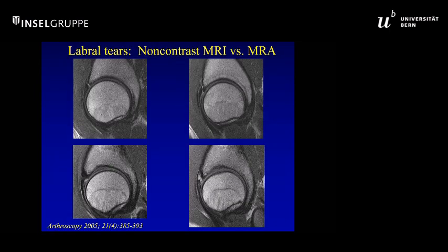So I published some time ago the use of non-contrast techniques, and now with deep learning techniques that are available in denoising, we can get very high-resolution scanning that, in my opinion, obviates the need for intra-articular contrast. These are 4 different patients with 4 labral tears that are very easy to see.